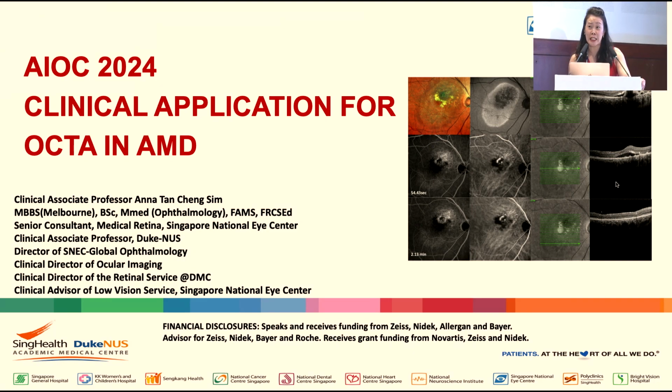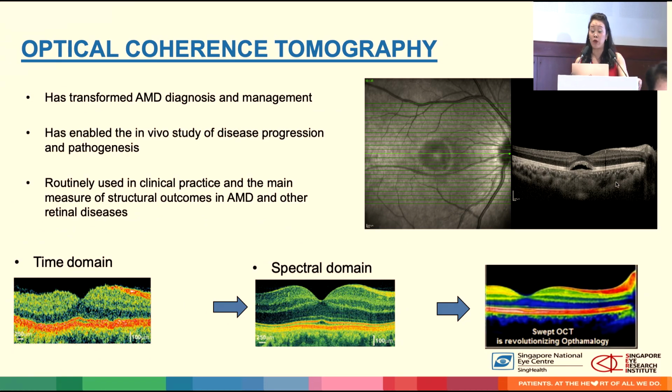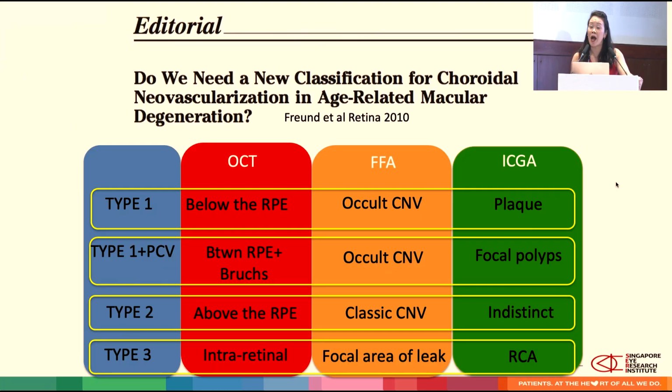I think the previous speakers already introduced OCTA. We know that OCT has really transformed our clinical management all the way from the days of time domain to swept source now. In AMD, it's not a new classification anymore, but instead of the fluorescein classification which was used before, we now classify AMD according to the histological layer of where it is.